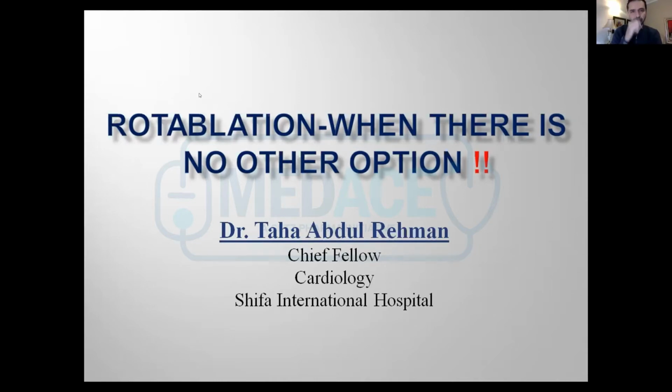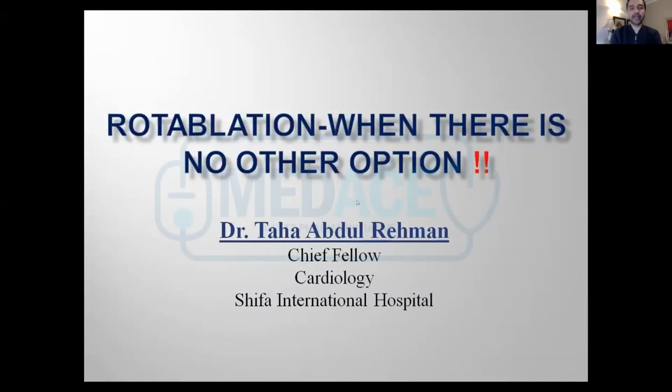So while we're waiting for him to get started, there was a case from last time where there was an under-deployed stent, and in an acute situation, there were questions asked about whether we can use the rotablator in that scenario or not. So, thoughts from the panelists on that. We would never. If you want to do a stentectomy and get the rota stuck, absolutely. So that was a question that we had over here.